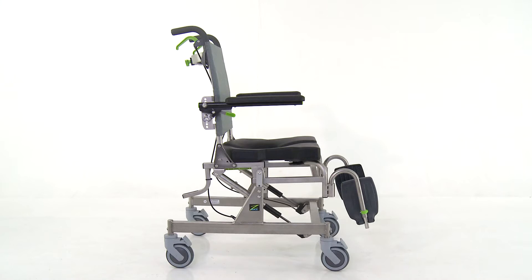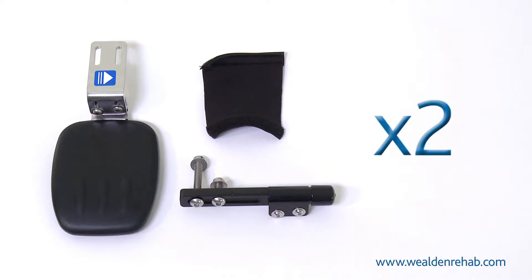The tools needed for this assembly are a spanner and an allen key. The lateral supports are supplied in pairs and are handed for left and right. Each side has a lateral support pad, a neoprene wrap, and the mechanism which comes with two bolts — one long, one short.